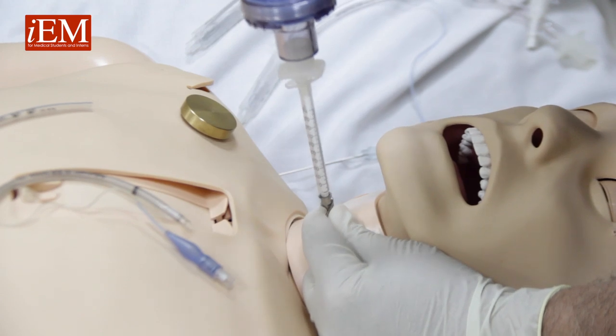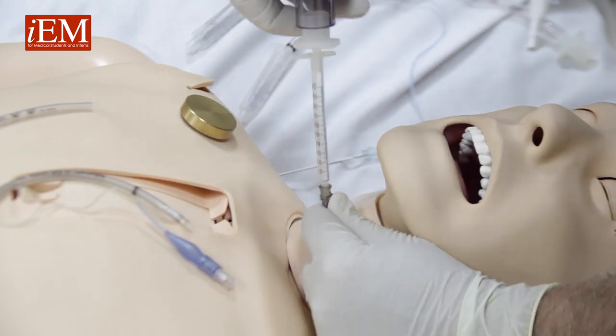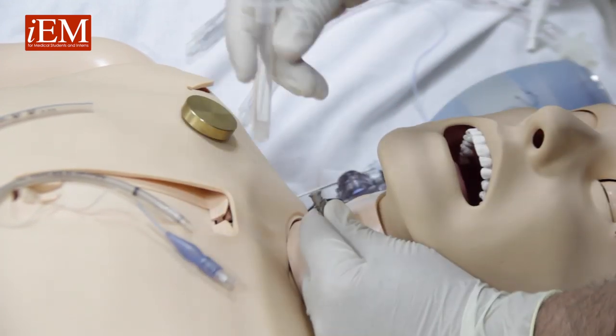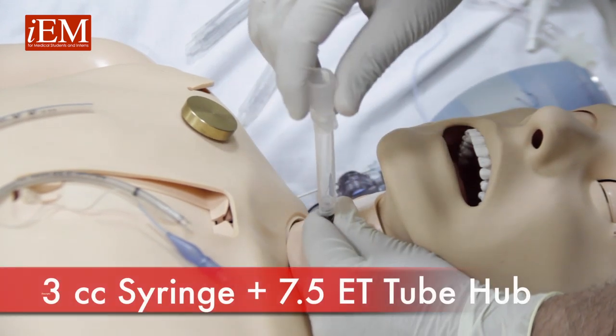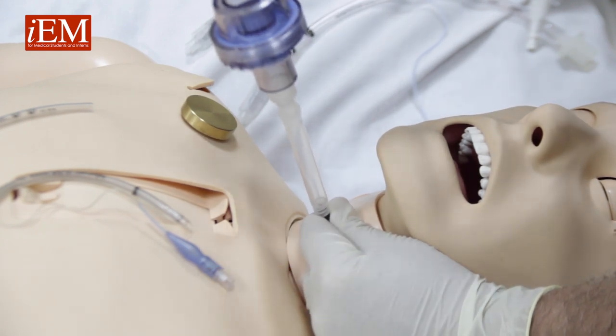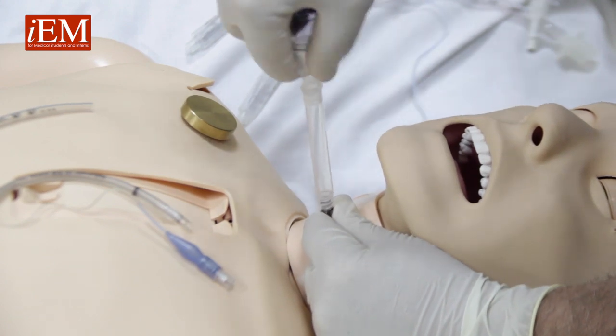The other option: we can take a 3 cc syringe connected to the cap of a 7.5 endotracheal tube, and again we can ambu bag. So you have more than one option to ventilate this patient through the catheter.